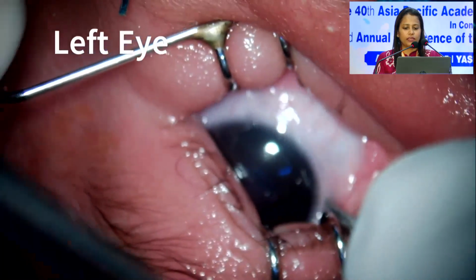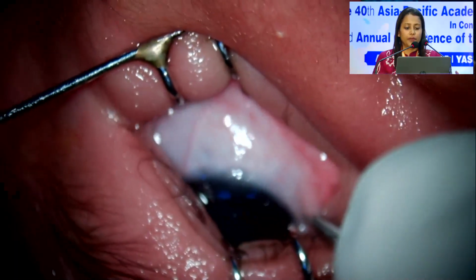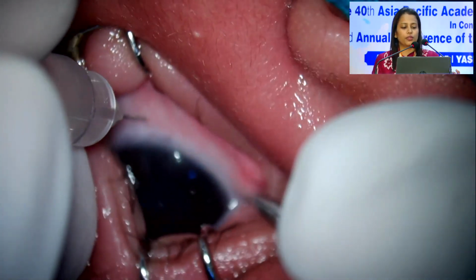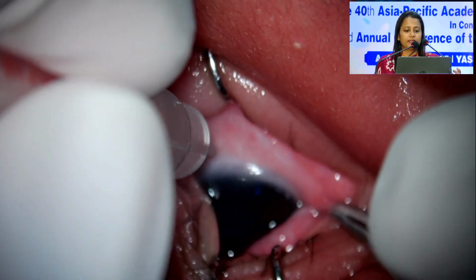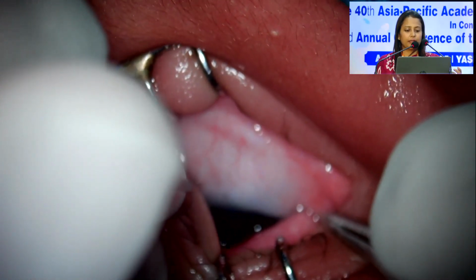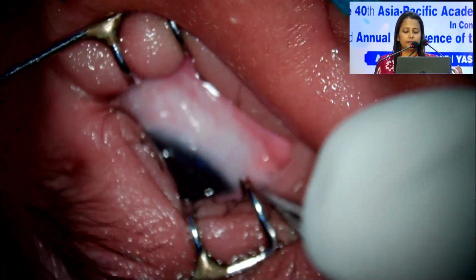So this is one image of us injecting a baby, but it was so difficult to actually take a video. So it's not very clear. But it just has to be the usual, in adults it's usually between 3 to 4 mm. This is just 1 millimeter from the limbus. And if your needle is 4 mm, you can go till the hub. If it's 6 mm, then you go halfway through. Go absolutely straight because the lens is more globular in the child.